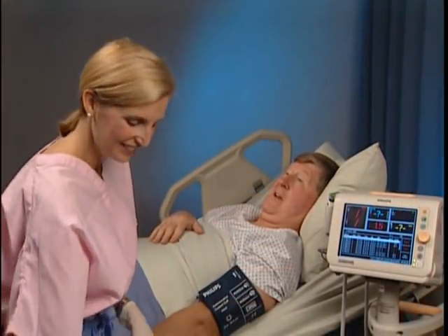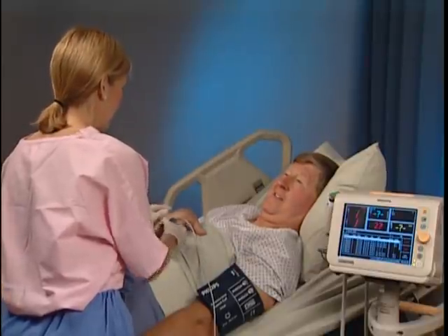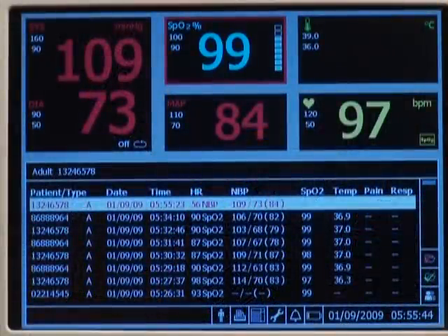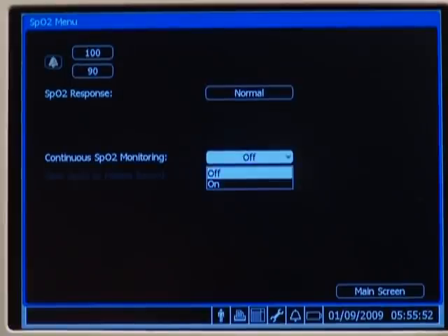You can also choose to continuously monitor a patient's SpO2 and save the SpO2 measurements to a patient record at a specified interval. Open the SpO2 menu, select continuous SpO2 monitoring, and select on.